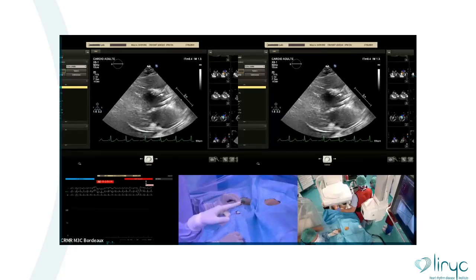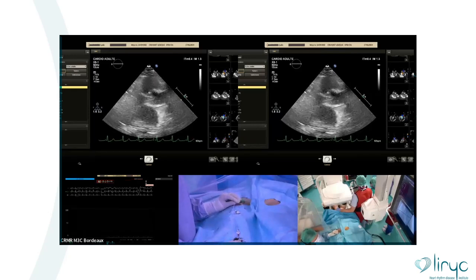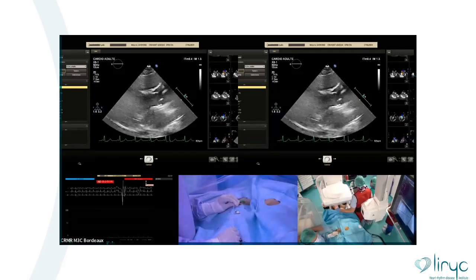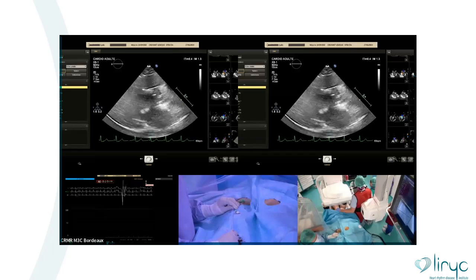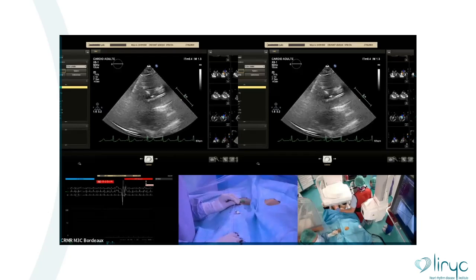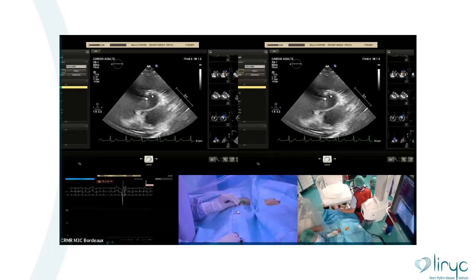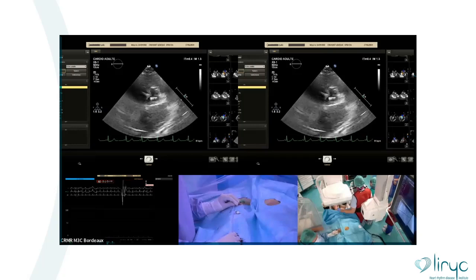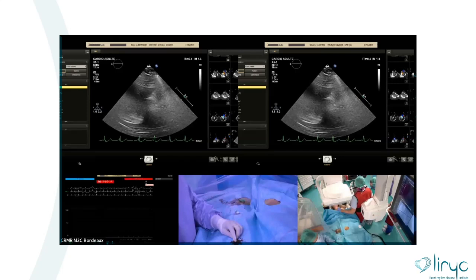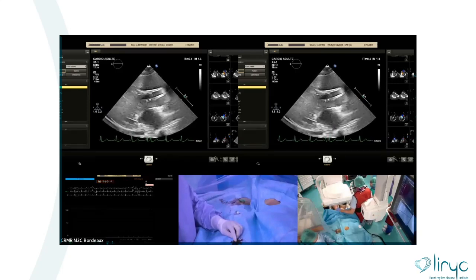Pass the aortic valve again. Pull back the catheter, rotate, and try to advance again. Good. Too deep, pull back. First take the wire out. No wire inside. Okay, good. You're in the LVOT. Rotate the catheter, adjust the direction, rotate clockwise. Good job. Try the wire. Always give a long axis view of the aortic artery. Good job.